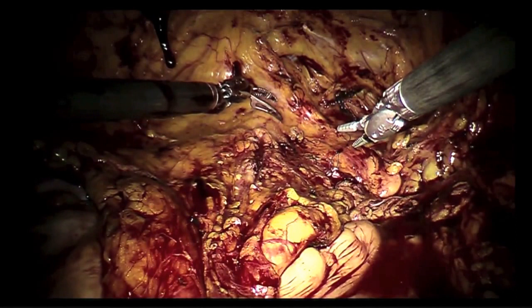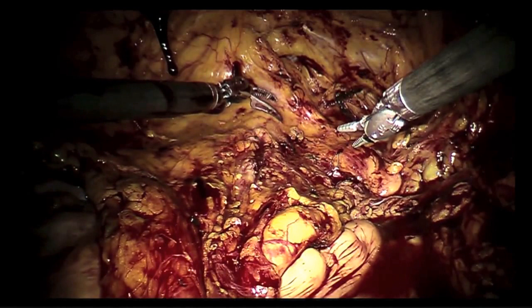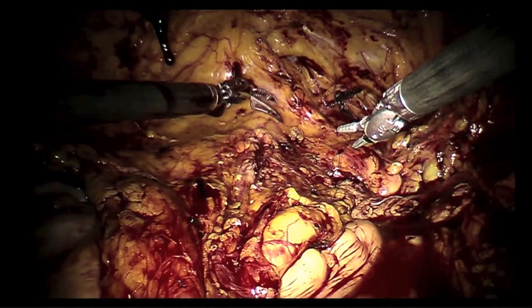I'm discussing with Dr. Platt over here. The basics of the operation are good. And so if we can do this for pancreas or something, that'll be so nice. Test operation, you don't have any problem. You know, warm ischemia is important. Yes, very, very important. I agree. So today, the ischemia time was 20, 30 minutes, something like that. I should have checked. 45 minutes. No, just the anastomosis time was what? Just the anastomosis, 25 minutes.